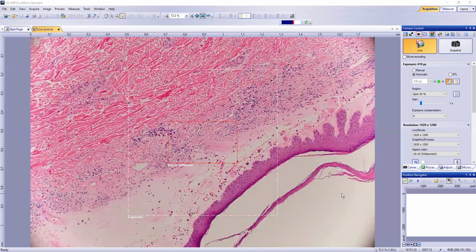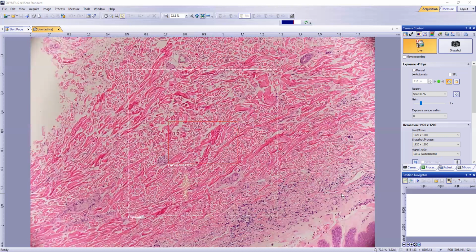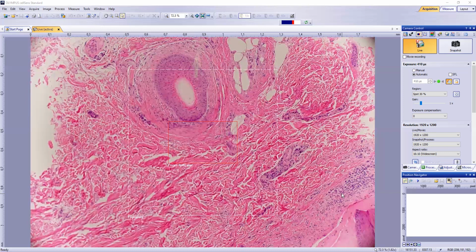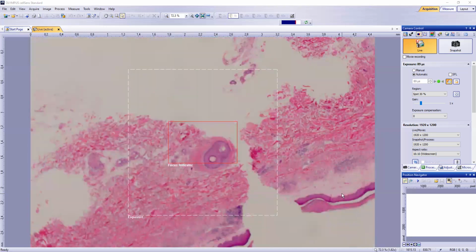The reticular dermis, in contrast to the papillary dermis, is unaffected. So you don't have sclerosis of the reticular dermis, which is another distinguishing feature between lichen sclerosus and scleroderma, as we'll see. And then the last feature I want to highlight is the fact that the adnexal structures in lichen sclerosus are relatively unaffected, and you can see some eccrine glands and hair follicles in the deep dermis.